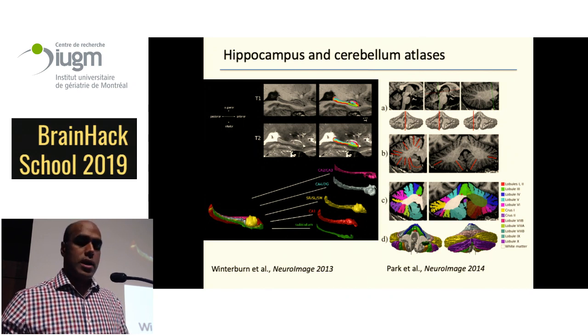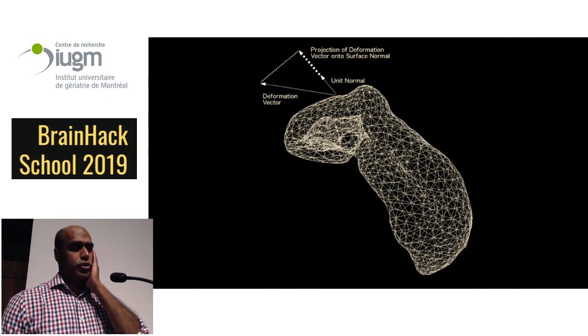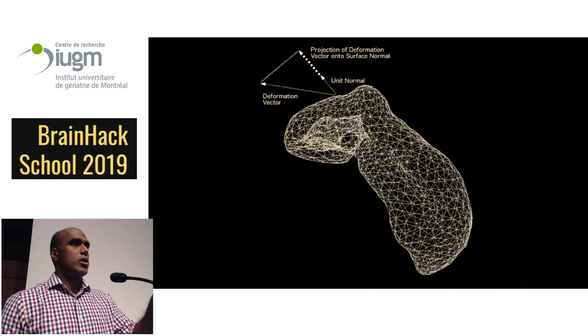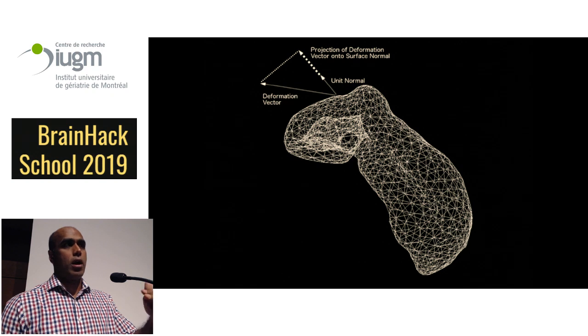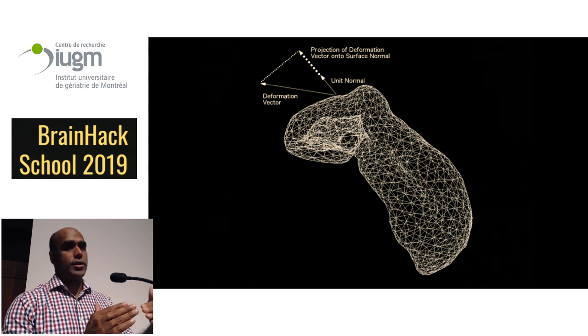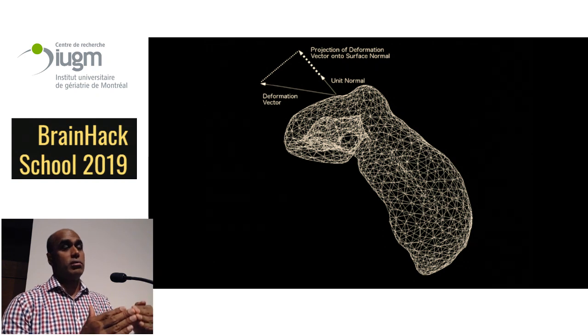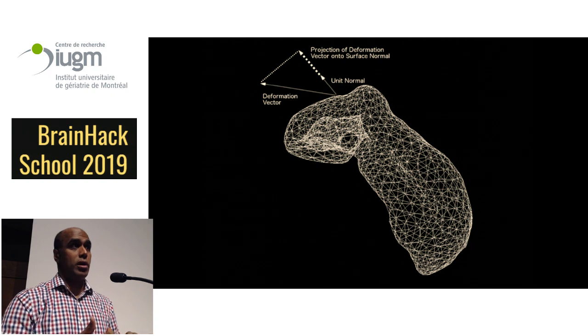And the other thing that we provide as output are these surface-based measures, which give you more localized measures of the morphometry. So, one way to think about it is there's 2. One that's just based on the unit normal here, where you're basically seeing how far, relative to the group average, one individual travels at each point in space along that unit normal, outside or internally, right? So you have a little bulge there, or a small indentation there, right?